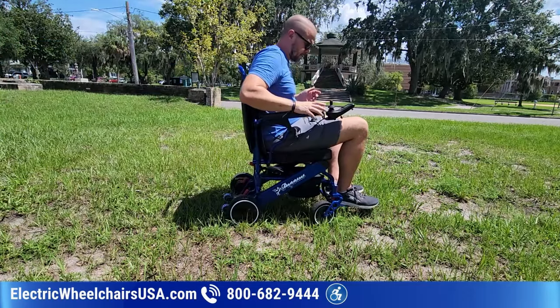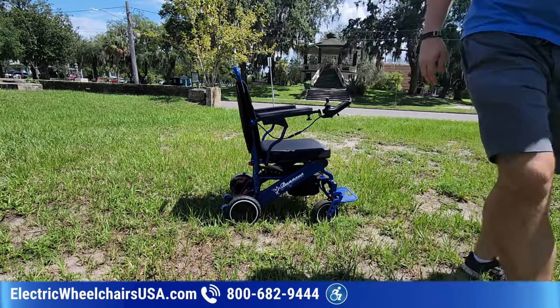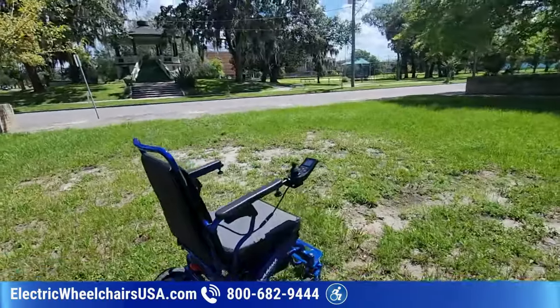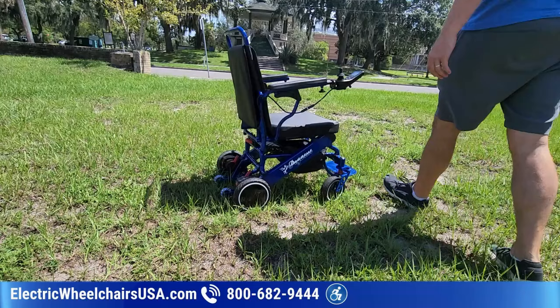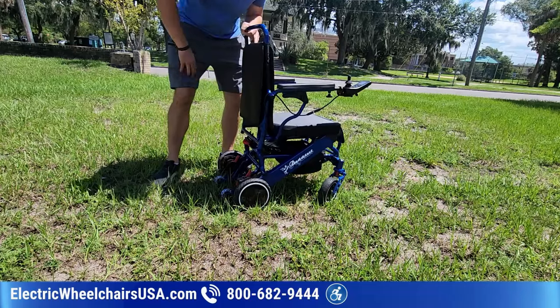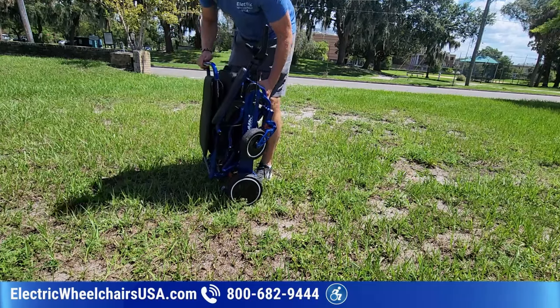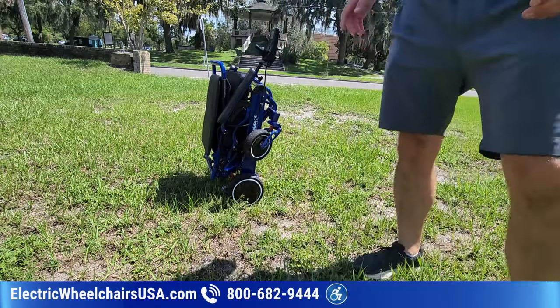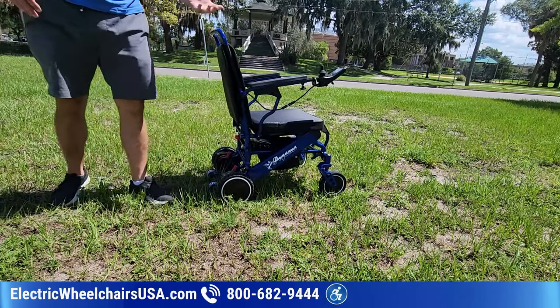And I think one other thing I forgot to point out about this chair is how to fold it. It's kind of important. It folds very similar to a lot of chairs that you see, but see there's a little red tab here. That's what you use to release it and to allow it to fold. So I'll just demonstrate real quick for you. First step you always want to do is flip up the foot plate. And then once you do that, you just press this red tab and that breaks the kink in it. And then I can just fold it up like that. And this chair can sit up like this, so you can store it easily in your closet. And then as far as unfolding it, just grab the back and it's super easy to unfold.